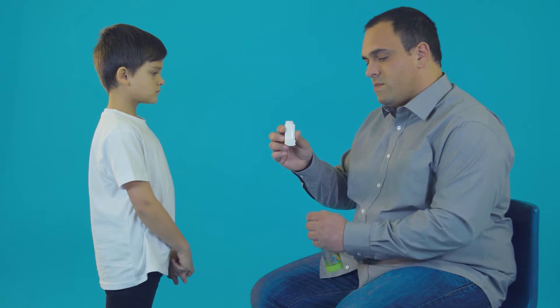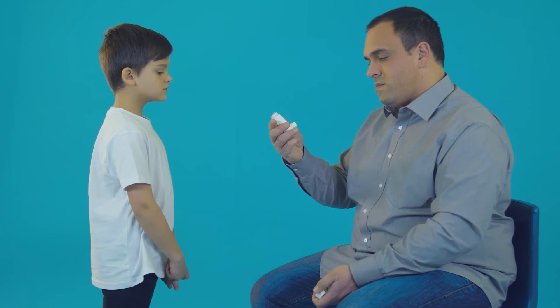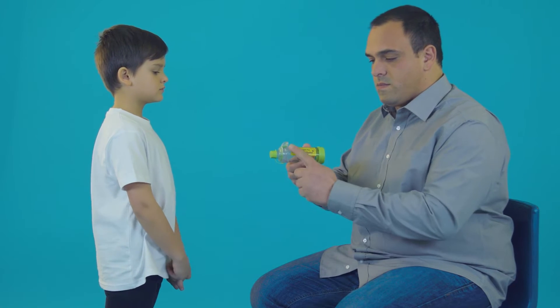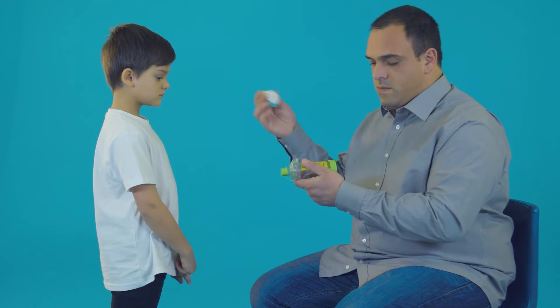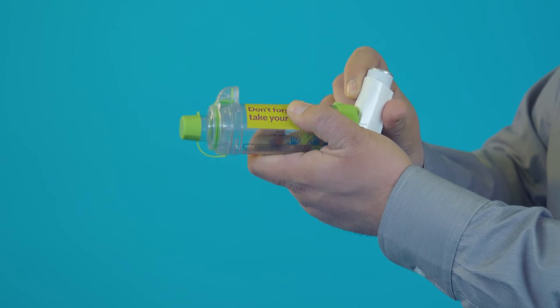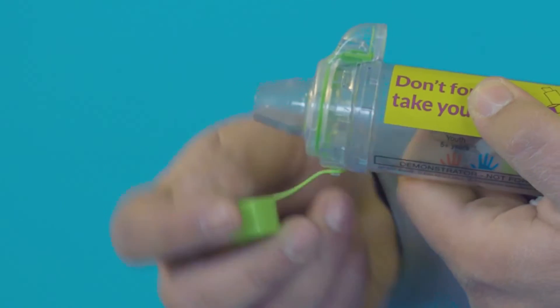To use the inhaler, hold it upright and take off the cap. Check there's nothing inside the mouthpiece. If the spacer has a valve, make sure the valve is facing upwards. Shake the inhaler well. Put the inhaler into the hole at the back of the spacer. If the spacer has a cap, take it off.